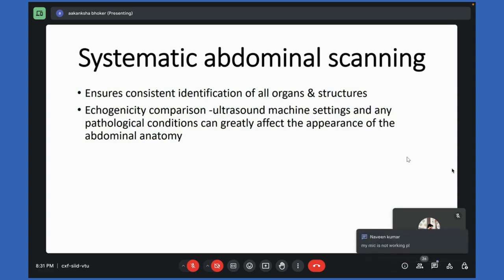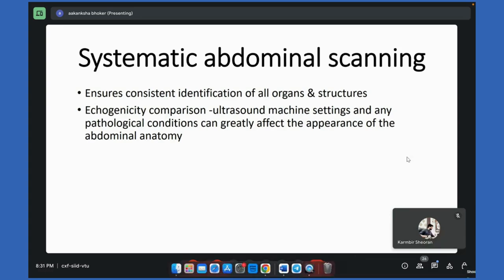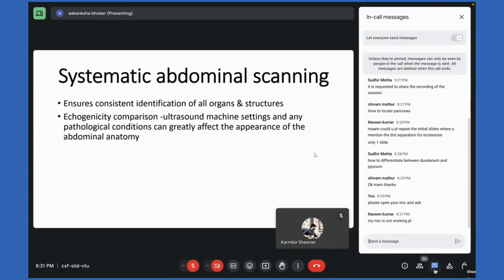Ma'am, how to differentiate between the duodenum and jejunum? Between the duodenum and jejunum, okay. Generally, as I told, the duodenum starts at the right quadrant. It will be located on the right hand side. The pylorus will be there, and then there will be the pyloroduodenal junction. So the duodenum will be located in the right cranial quadrant. It will start from there and lie more superficially. I told you first there will be the duodenum, followed by the pancreas. So when we slide laterally and caudally, we can scan throughout the duodenum.